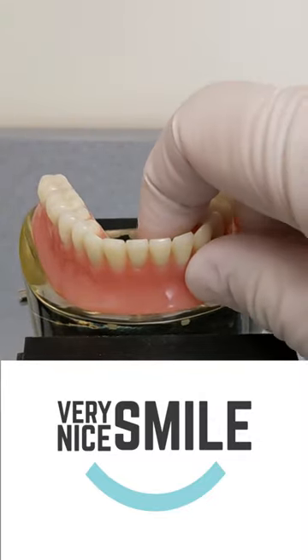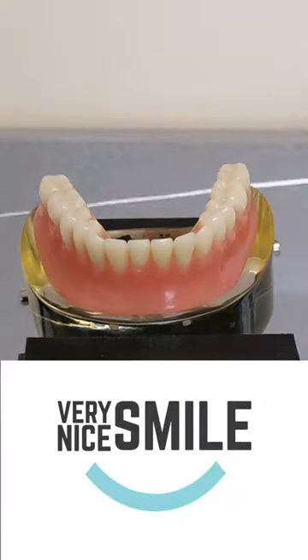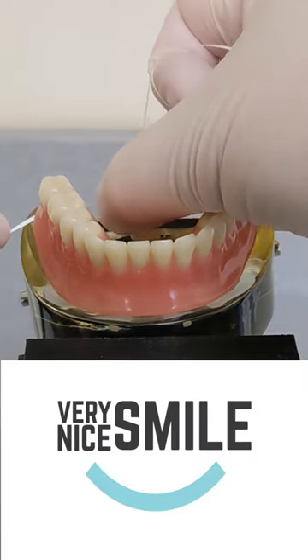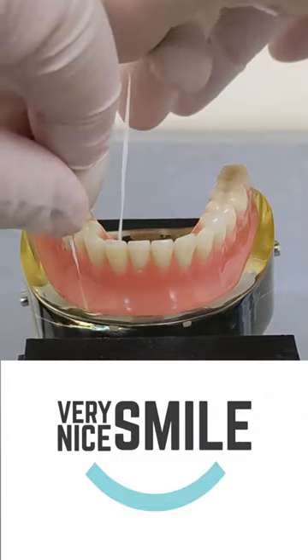Do you have trouble removing your snap-in denture? Here's a simple technique one of my viewers invented. Take a piece of dental floss and hold it in your hands as if you were going to floss your teeth. Pass the loop of the dental floss underneath the back end of your denture. You only need to do one side at a time.